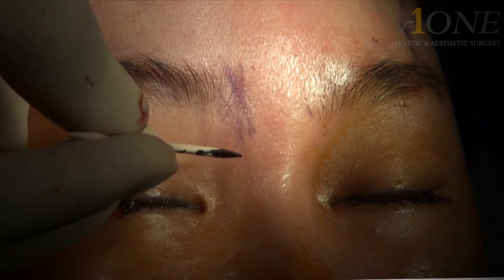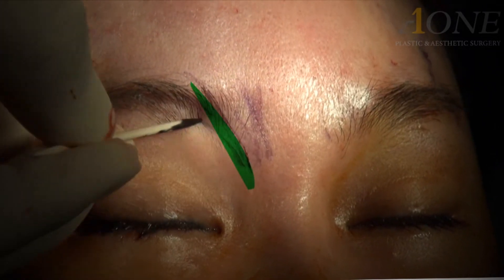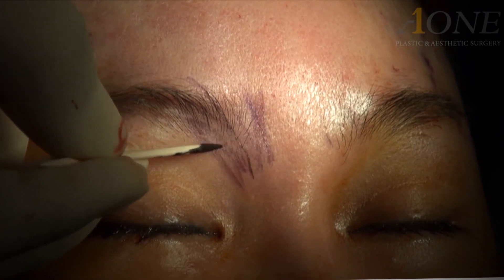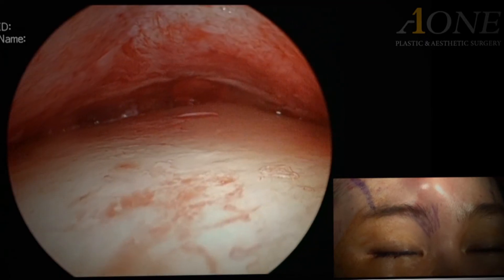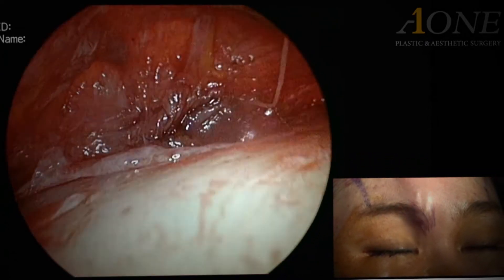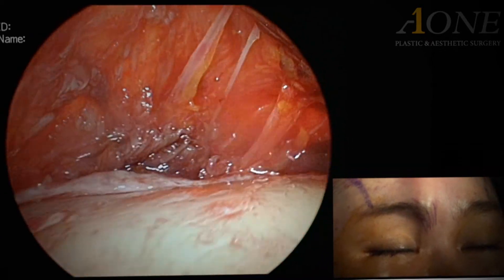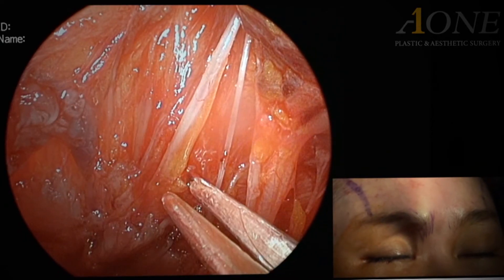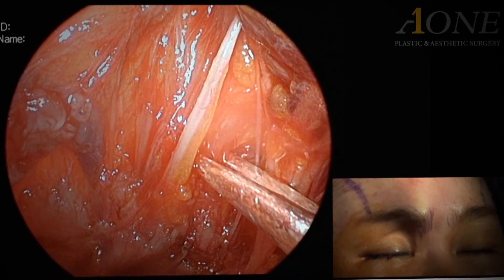Next, the preseptal portion of the orbicularis oculi muscle that wraps around the eye area must be cut. It is positioned above the DS muscle. Can you see the muscle fibers? It is the muscle fiber of the preseptal portion of the orbicularis oculi muscle.